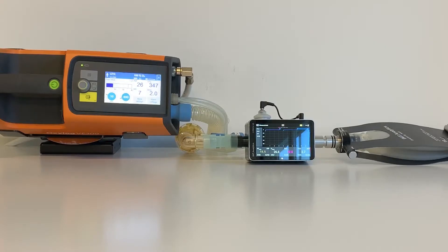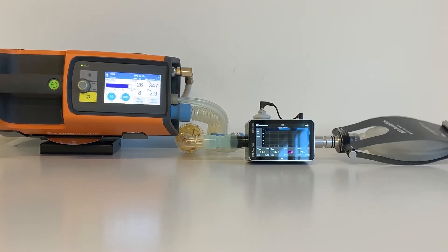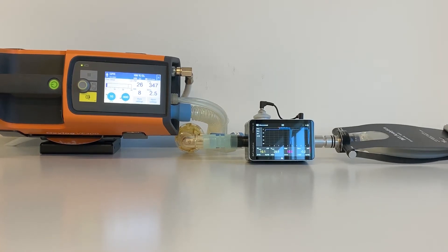Let's start the test. Set up the OxyLog Ventilator, Citrex Gas Flow Analyzer, and a test lung.